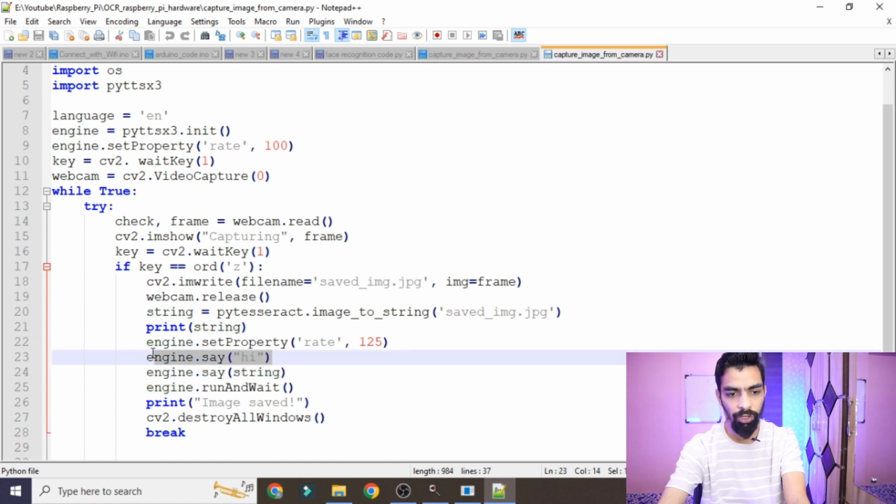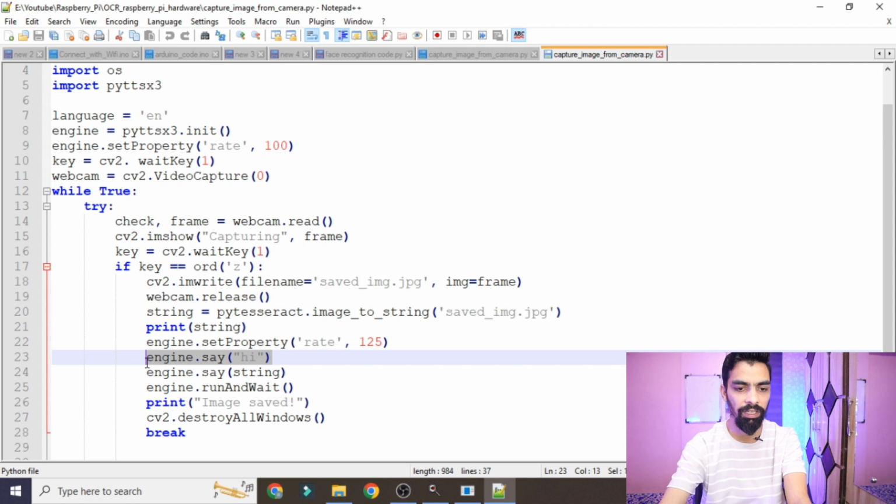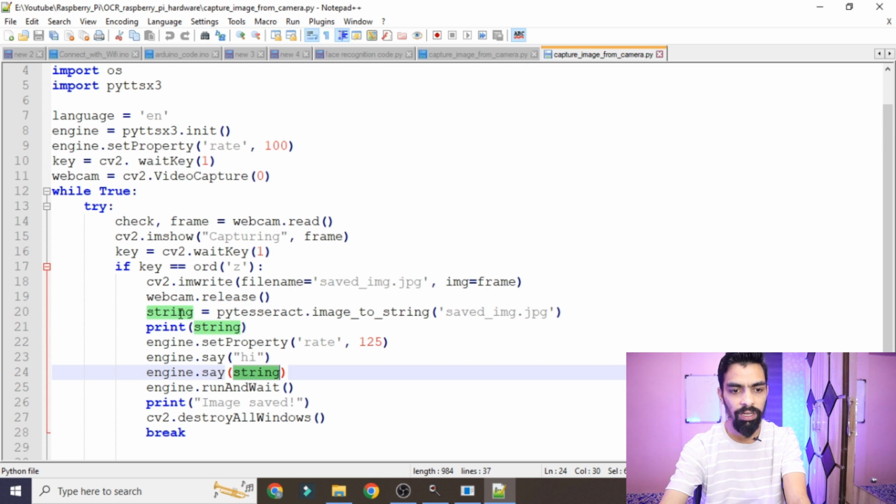So this "hi" you can ignore, but it is very important to add in this line, because I found during my practical demonstration, when I was doing this R&D, that if I give this line directly, it will skip some words. So to avoid that, I just print one default string here, "hi". It will skip "hi", but this line is very important. It will not say hi, but it will skip that and actually start speaking our string that is captured from our image. In this line, engine.say.